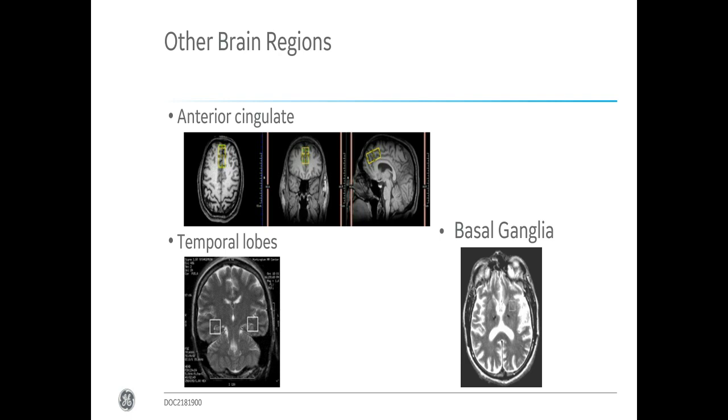You have to be very careful that you are not too close to the skull. Because it's very close to the sinuses, you get some susceptibility effects, and therefore the quality of the spectra is sometimes more difficult to get good in this area, so it's a more challenging area.